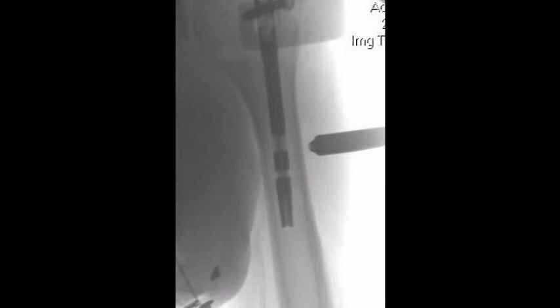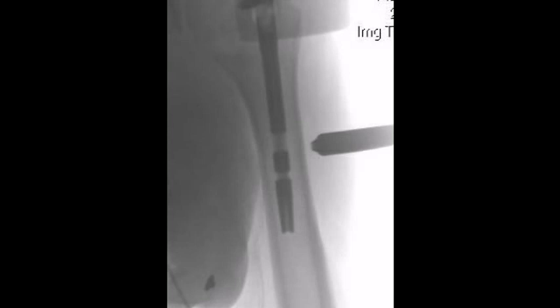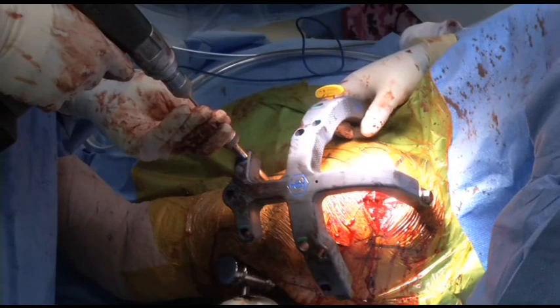The distal screw is placed via a targeting jig. The sleeve is placed via the jig against the bone through a percutaneous incision. This screw should be oriented in a lateral to medial fashion, as viewed by the AP radiograph. In this case, only one dynamic screw was placed to allow immediate controlled impaction of the fracture site.